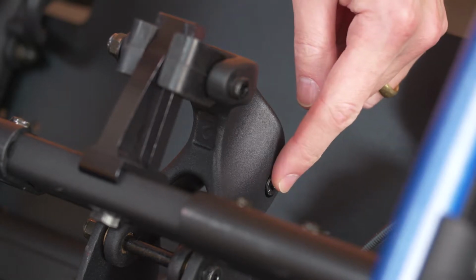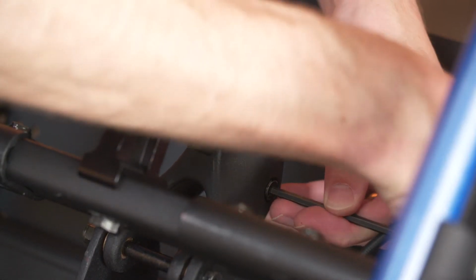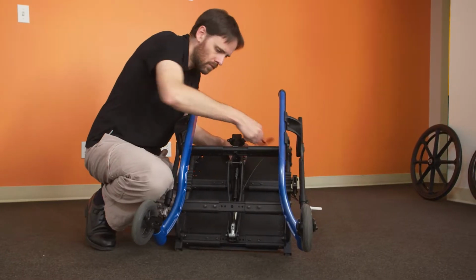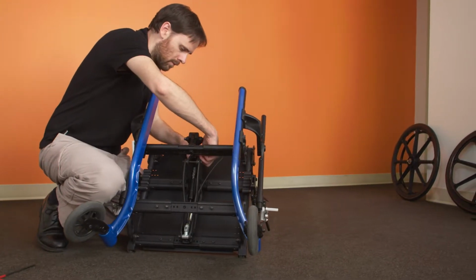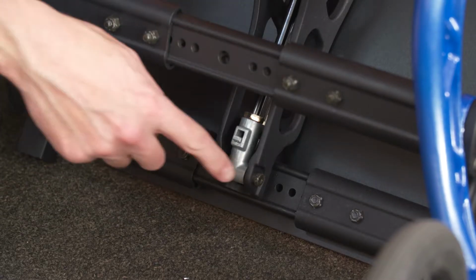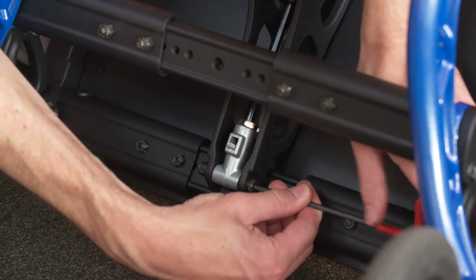Remove the fastener at the rearward end of the strut at the strut link. When removing the fastener, support the weight of the lower frame. Remove the fastener at the forward end of the strut at the upper frame strut mount.